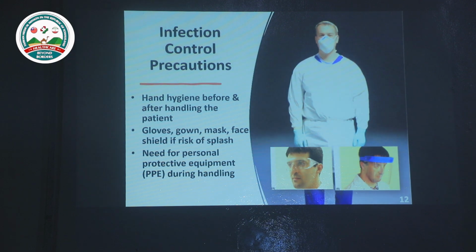Another precaution for caregivers: to prevent contact transmission, sometimes we need to wear gloves. To prevent respiratory droplet or aerosol transmission, we need to wear a mask. And sometimes, to prevent a splash of blood or sputum, we need to wear eye protection or a face shield.